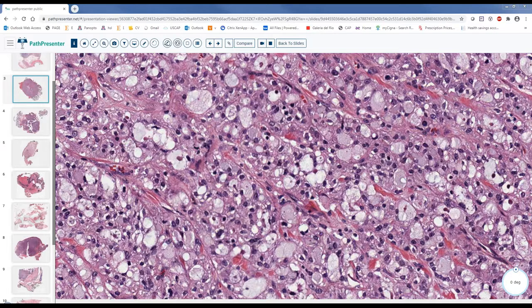They will be confused. If I just say secretory carcinoma, they will go checking whether this is a mucinous carcinoma, or sometimes metastasis from colon, believe it or not. So I'm spoon feeding them: secretory, so the WHO will be happy with me, and between parentheses, mammary analog secretory carcinoma. So they will see, oh, this is MASC, good, that's it.